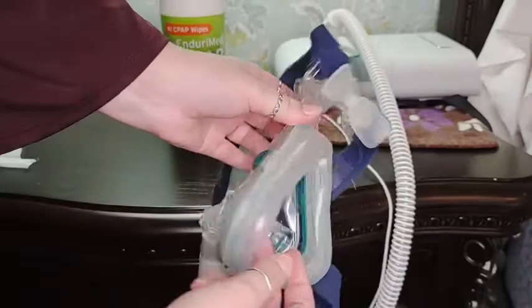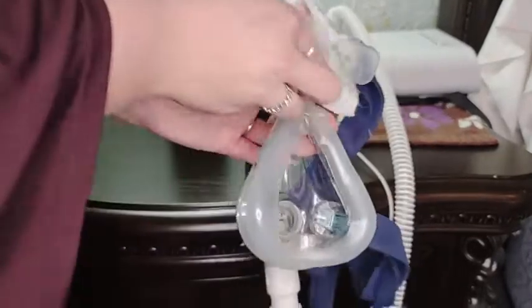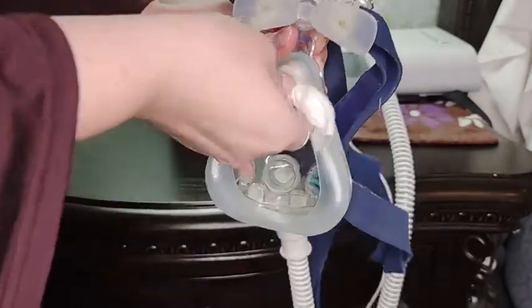You can see here that the mask naturally gets full of oil from your face and dead skin cells, but these wipes, with pretty little effort, just wipe them all away.